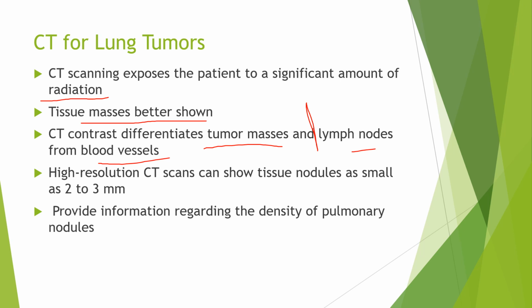So you can see how the CT can be very, very useful here. Instead of ordering a bronch, we might say, oh, let's do an EBUS, right? And go and sample that lymph node. Much, much different picture, right? So they're looking at tissue nodules that are very, very small, and we can catch them a lot earlier than even on some x-rays, which is pretty interesting.